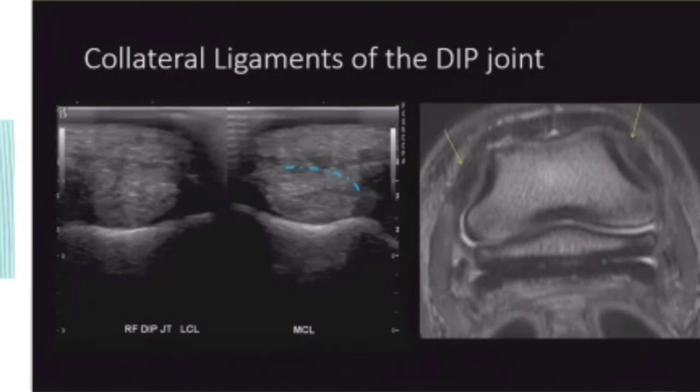So in one of the studies I did with the resident, we compared our ultrasound findings, again, pre-MRI and post-MRI, to see how good we were at assessing lesions. And it turned out that we didn't have a huge number of collateral ligament injuries, so we weren't able to get enough statistical strength to evaluate it. But what we did find was it's very unreliable.